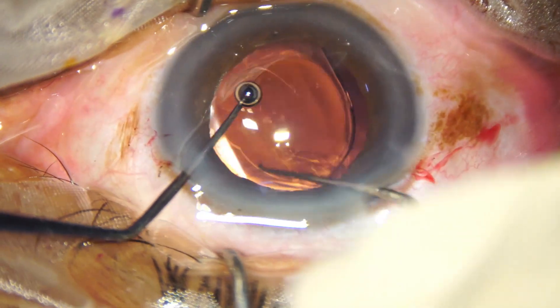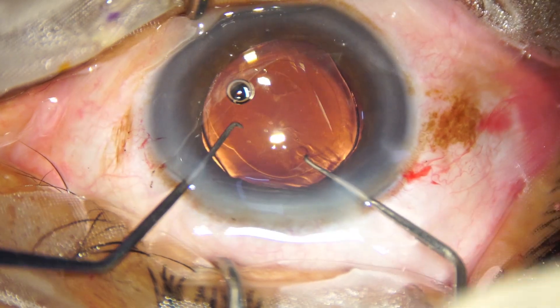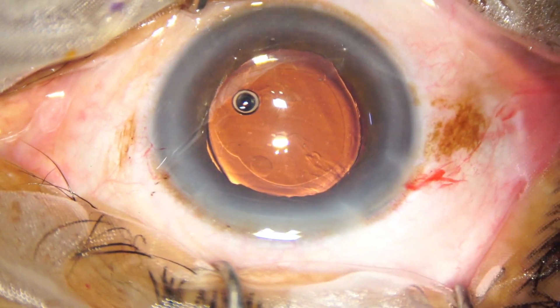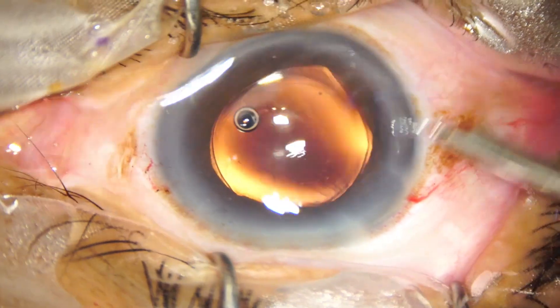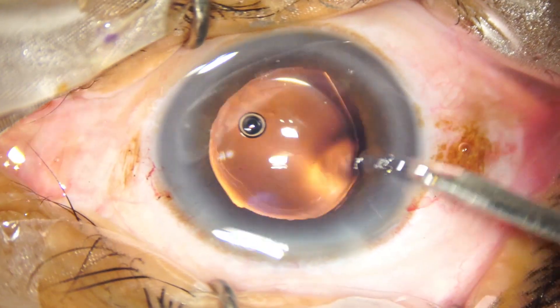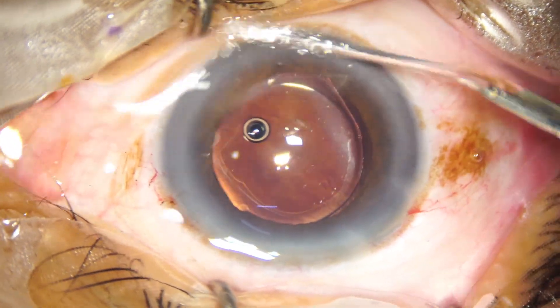The nucleus is dialed. The haptics are placed 90 degrees away from the main wound so that the irrigating instrument can easily go behind the lens.